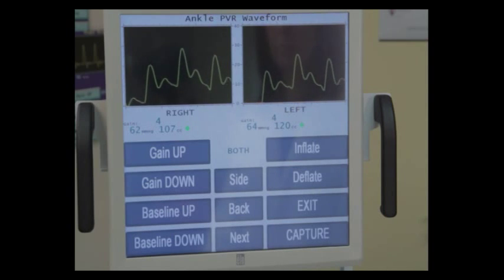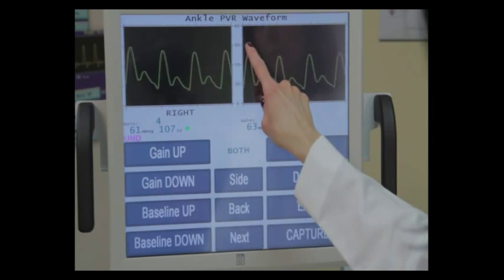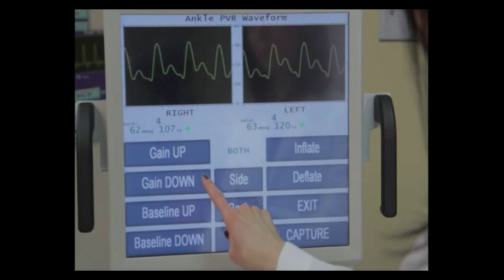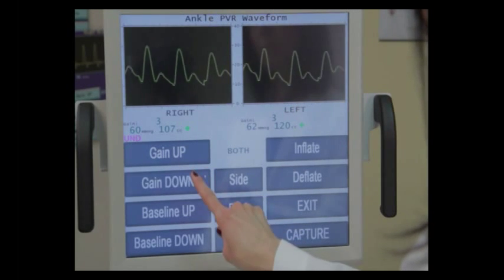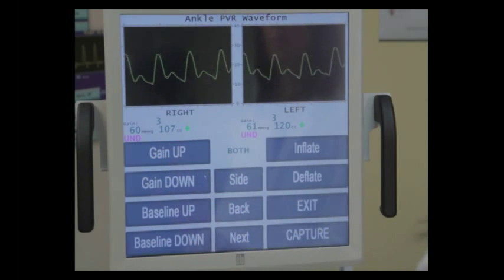Right now we're going to be looking at the gain, and we see that the waveforms are exceeding the 30 mark at the top and the 10 mark at the bottom. That tells me that when we go to the calf, we are probably going to be clipping the tops and the bottoms off of the waveforms. So we're going to move the gain down once, and then we're going to let our waveform stabilize, and then we're going to hit the capture button.